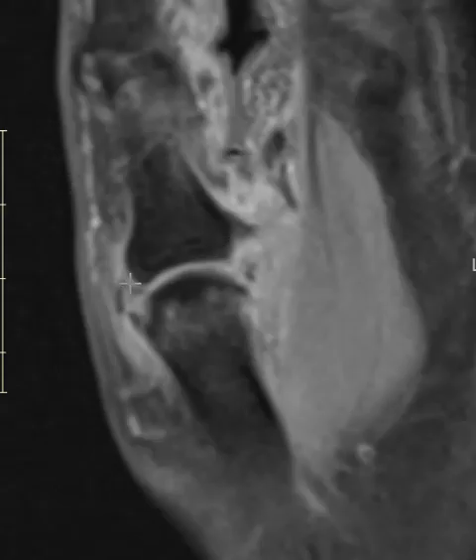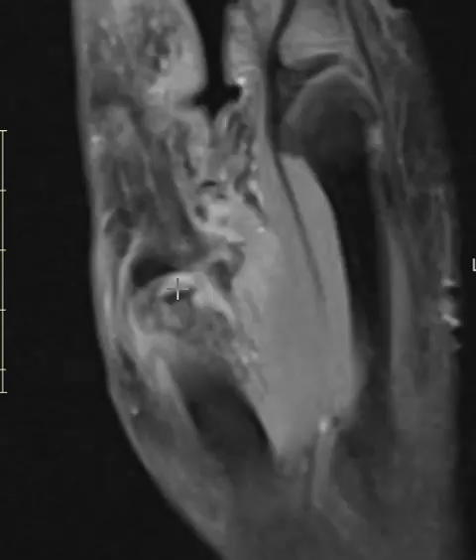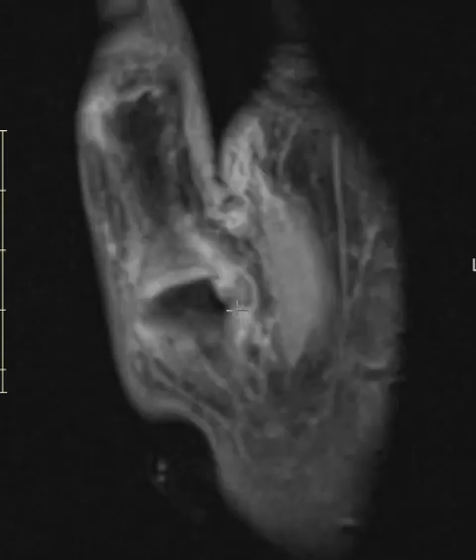They also have a tear of their radial collateral ligament — it's either a high-grade partial tear or maybe a complete tear — with abnormal signal here. The main thing I wanted to show you was that UCL tear with the retraction and folding. It will require surgery.